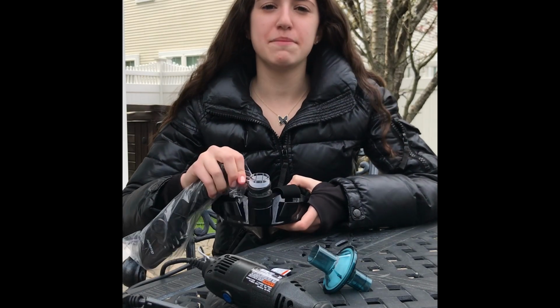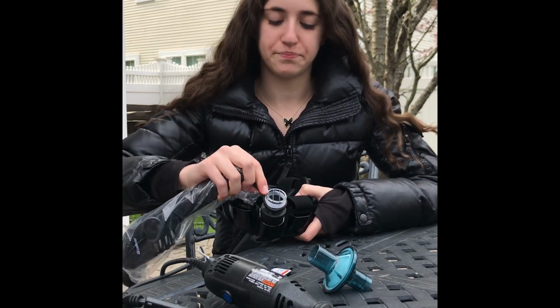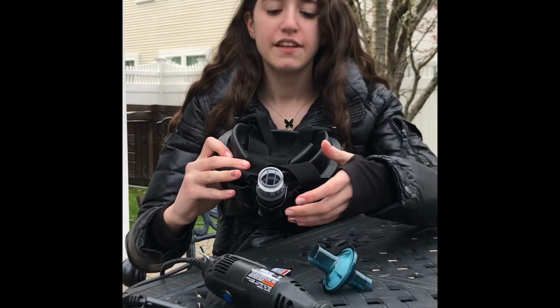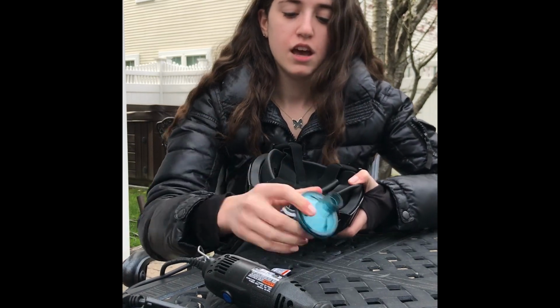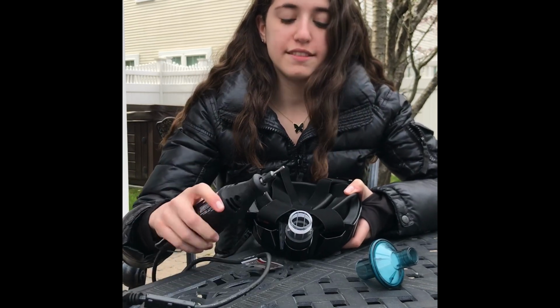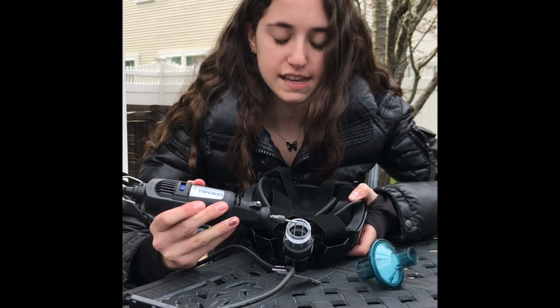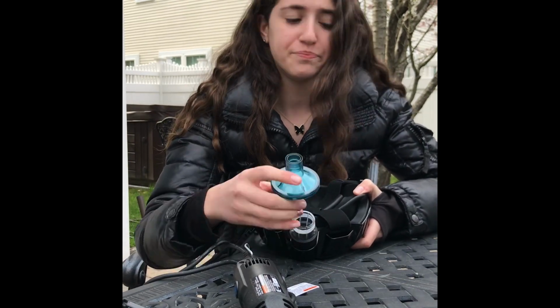In order to make the mask, you're first going to have to remove the snorkel piece that the mask originally comes with. Once that piece is off, it's clear that there's plastic pieces in the snorkel attachment that you're going to have to remove in order for the filter to fit, because currently it does not. I'm going to shave down the pieces with a Dremel, and as you can see, you're going to have to shave down both sides. Once those are shaved down, you can test and see if the filter fits, which it should.